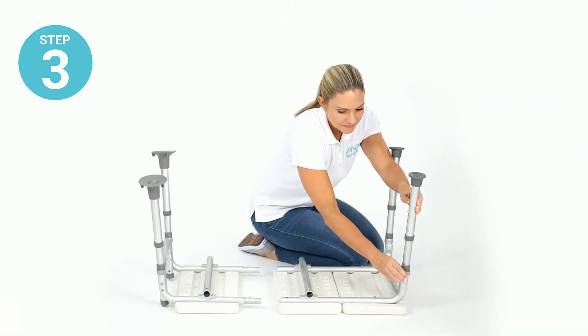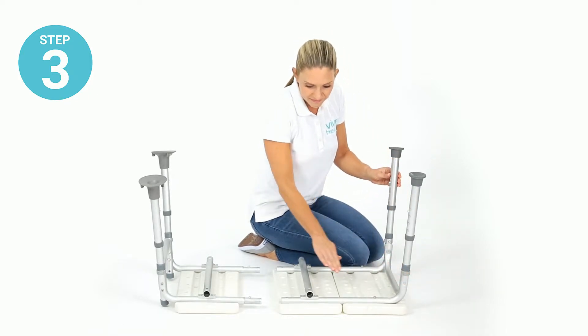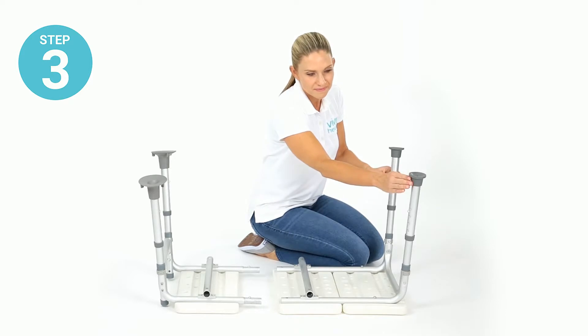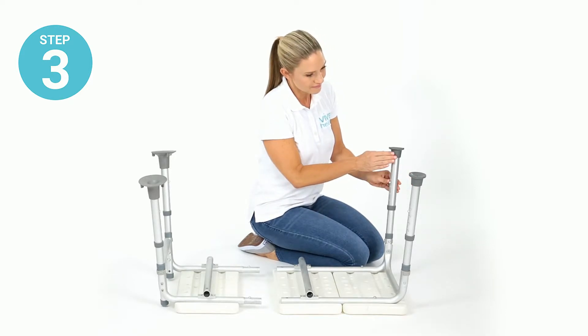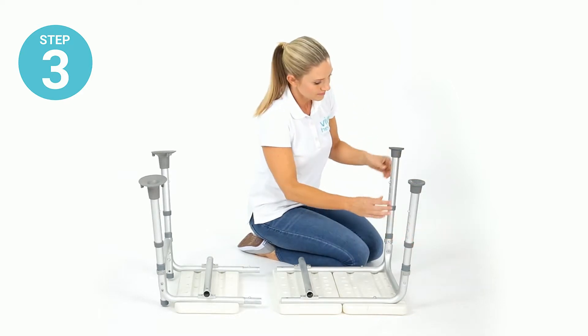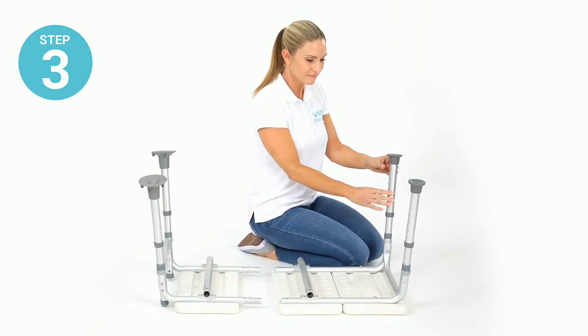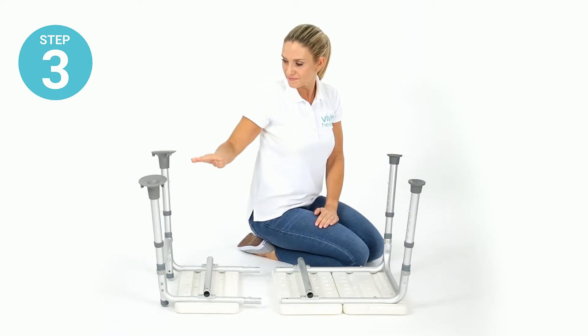Step three: install the other bench legs into the sockets on the large seat section. If needed, adjust the height of each leg by depressing the locking pin and pushing the leg section down until the pin locks into place. Make sure all four legs are adjusted to the same height.